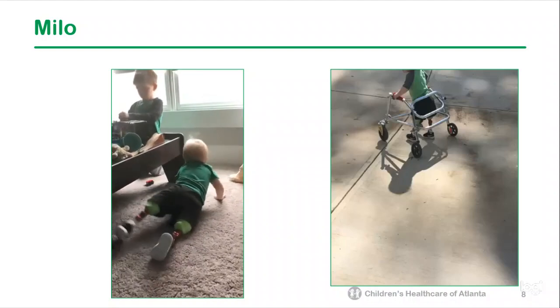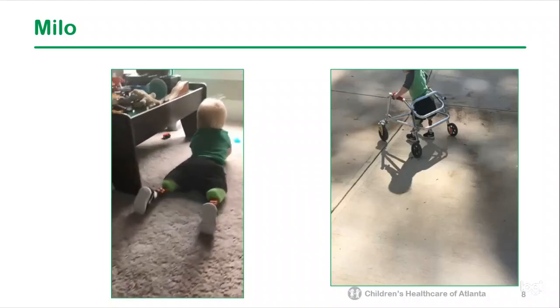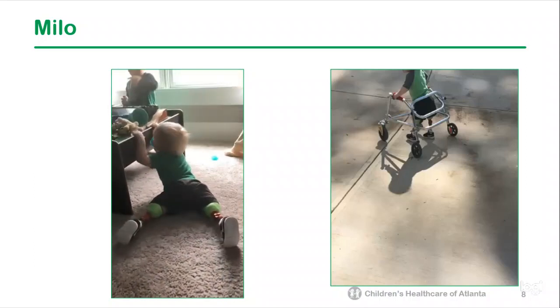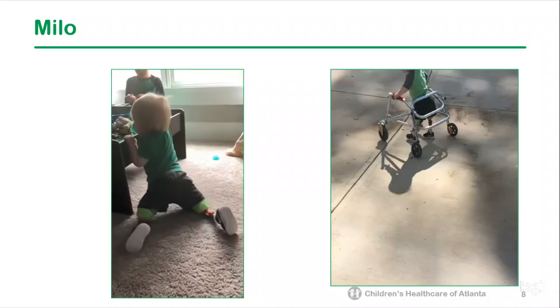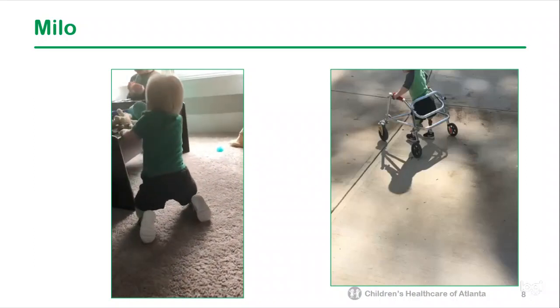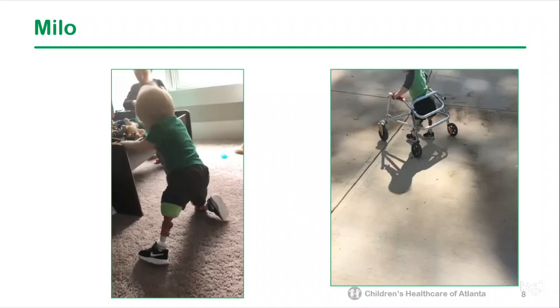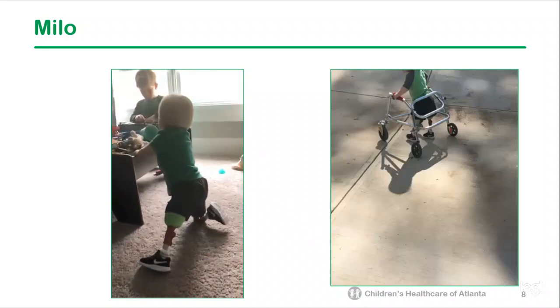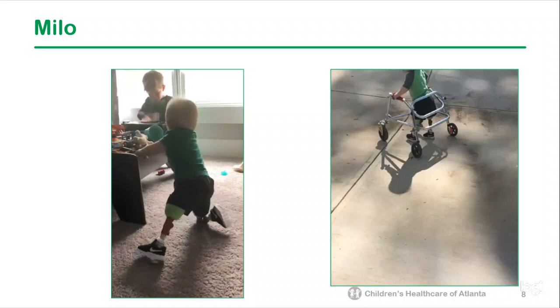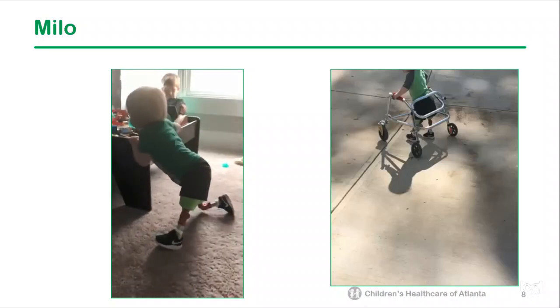Our goals for Milo initially were to have him develop a strong foundation in crawling, tall kneeling, pulling to stand, and then eventually walking. As you can see in this video, he is demonstrating the use of the knees during his transitions from prone to tall kneeling and eventually to standing.